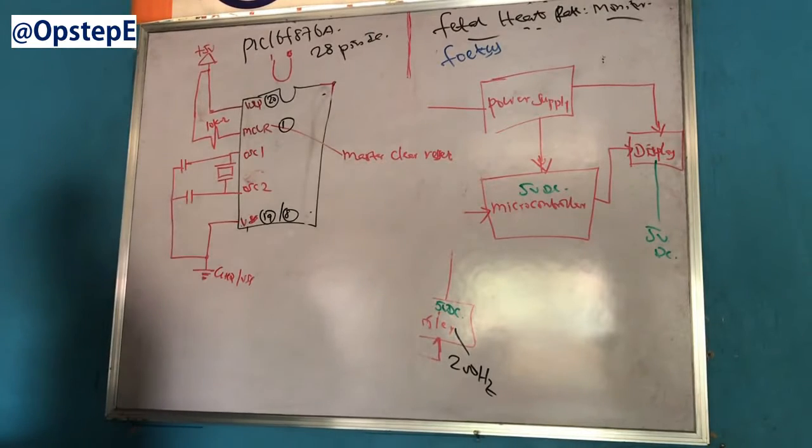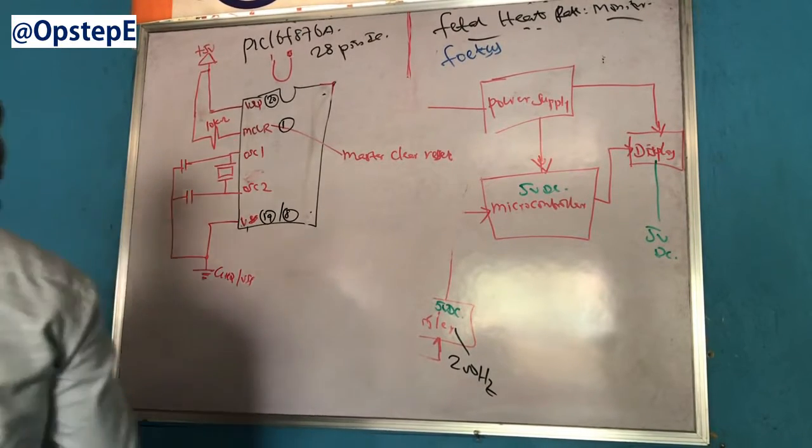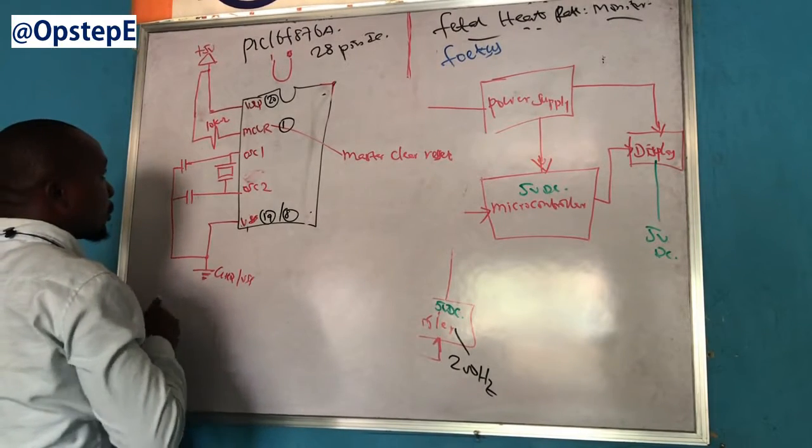Let me check for where the master clear reset is. Since you're asking, don't worry, I'll check it online. Let's continue with this. So this is going to be on your pin 9 and 10.